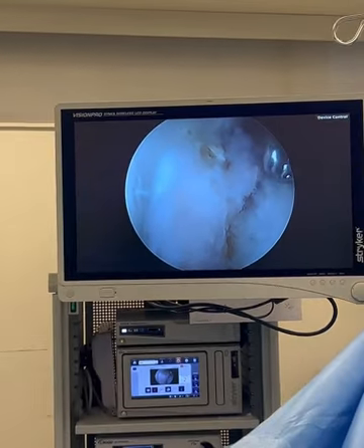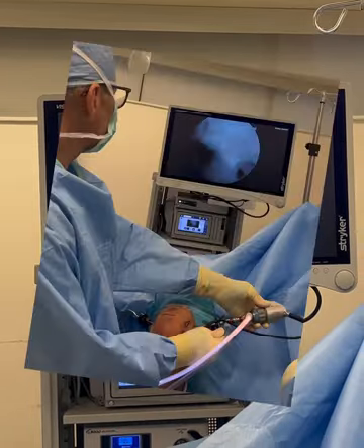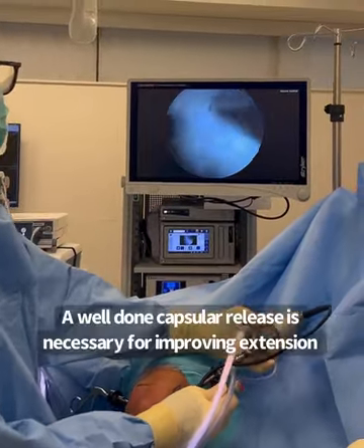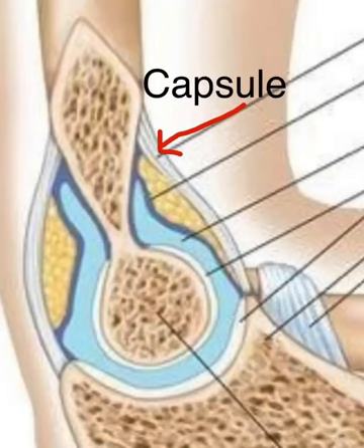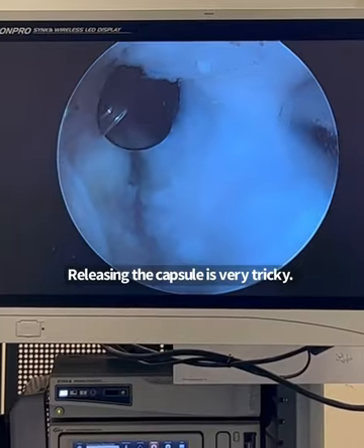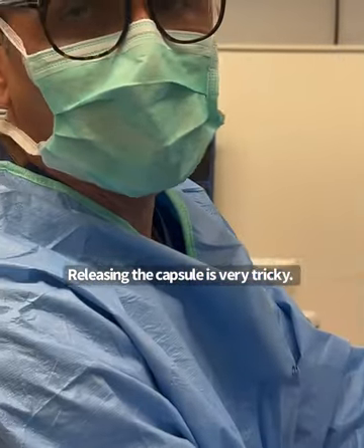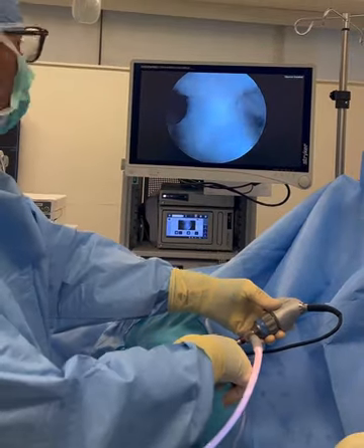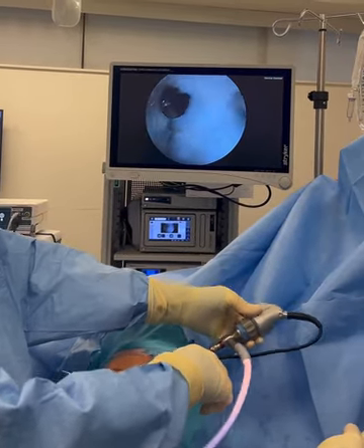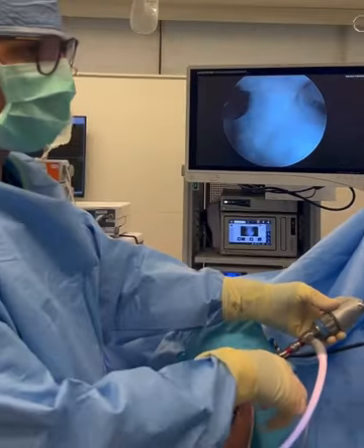The key is to only use suction when you absolutely have to. The capsule is this fibrous structure right there — it's very thick. The problem is that it does not let the patient fully extend their elbow. It is released at the end, because once it's released we lose our pressure in the joint and won't be able to see inside anymore, so that's the last part.